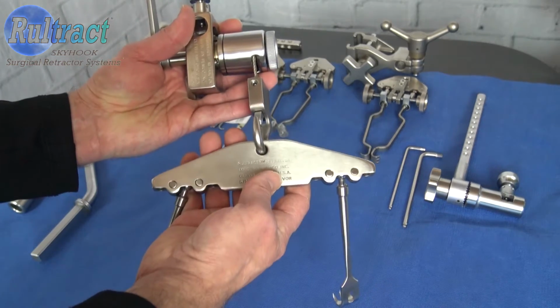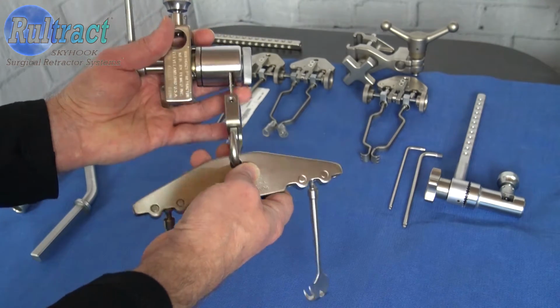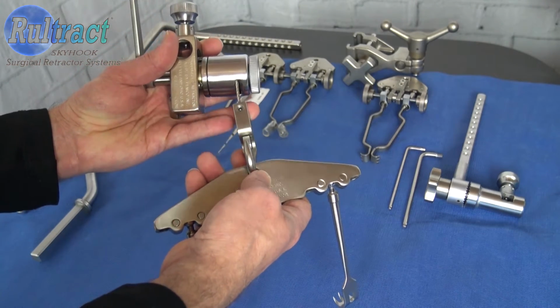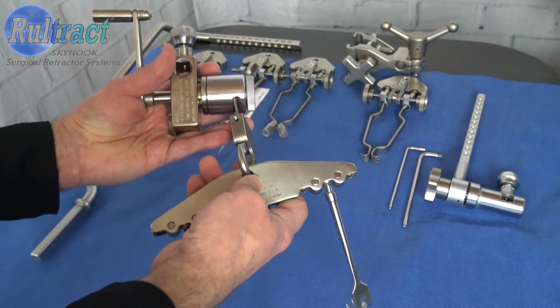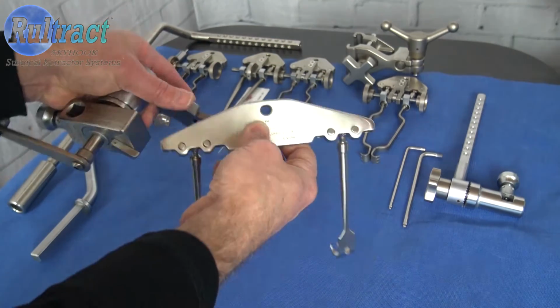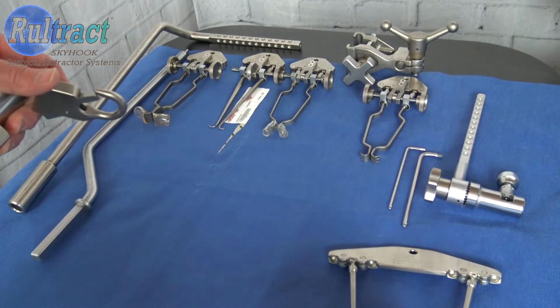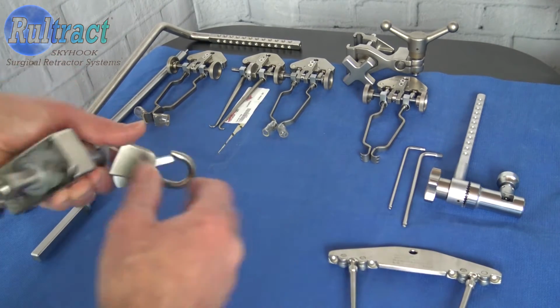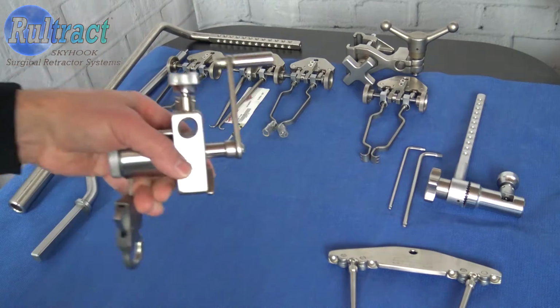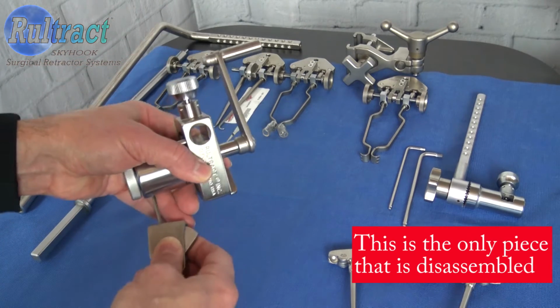So the first thing you're going to want to do is to remove your rake plate from your snap clip. Now your rake plate may not be attached to your snap clip, so obviously if it isn't, you don't have to do this. But the first step would be to remove your rake plate from the snap clip. And go ahead and set that rake plate aside and be aware those rake tips are very sharp. Next, we're going to pull the cable from the spool.